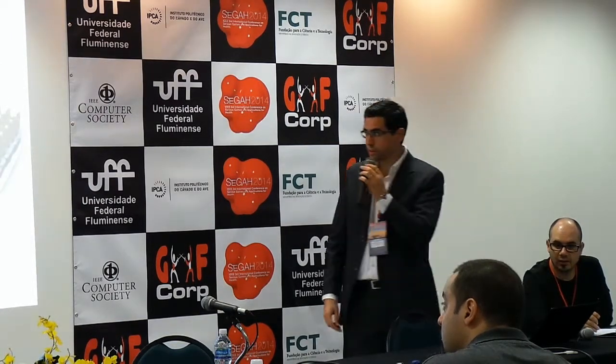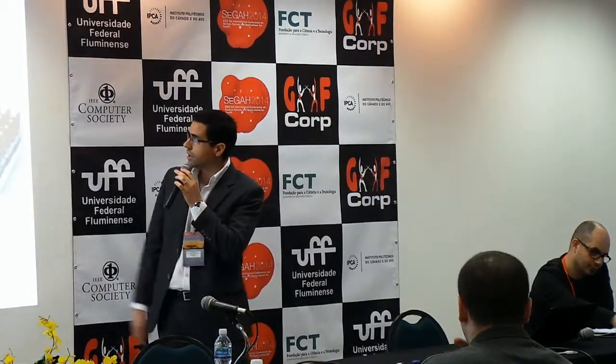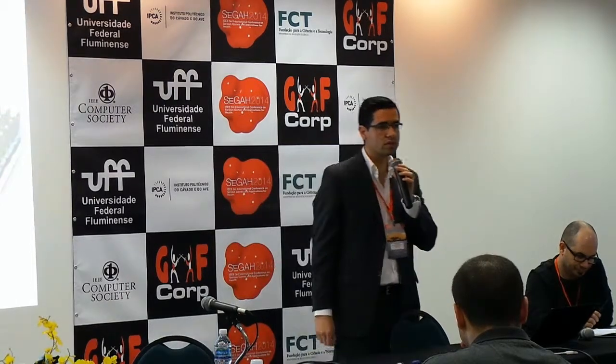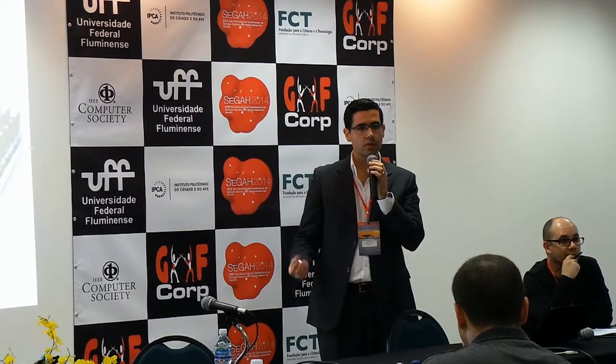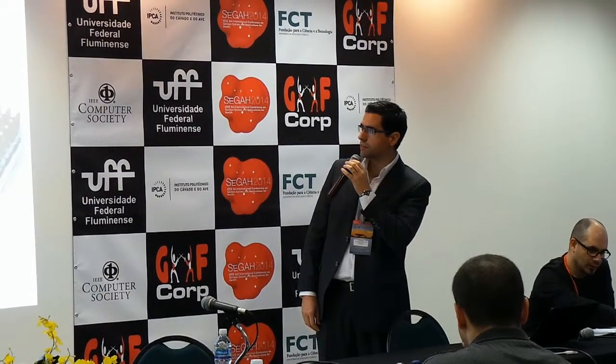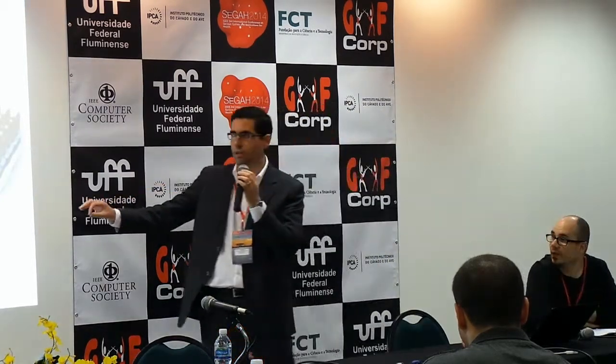The active dry electrodes that we are building are based on a 6x6 array of folded pins. It is the mechanical interface for the system, meaning that this is the place where you actually acquire the signals. It's the first stage of the system. It has a unity gain buffer embedded in the electrodes.